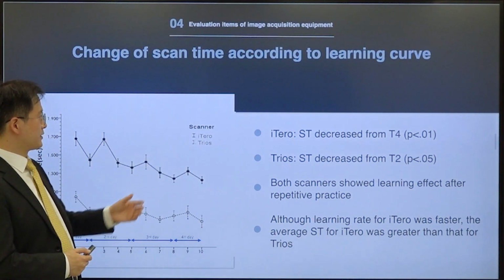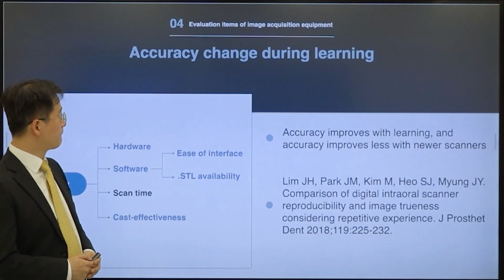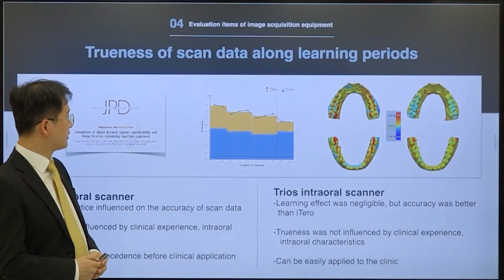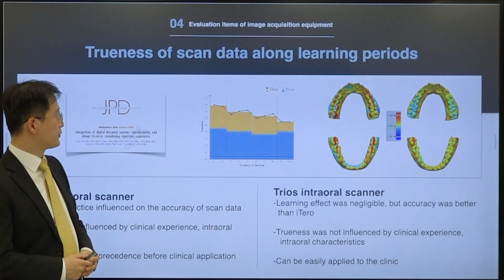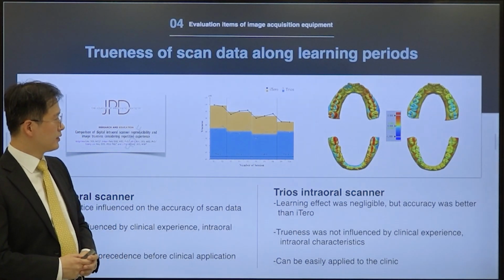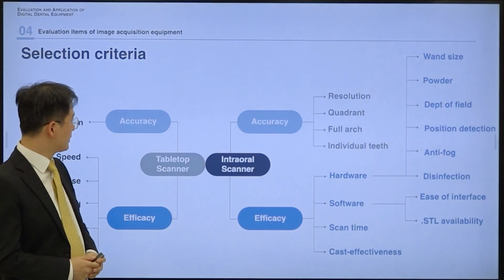So I did some research on the learning curve and the progress of accuracy, so you can understand about the learning curve and about intraoral scanners.